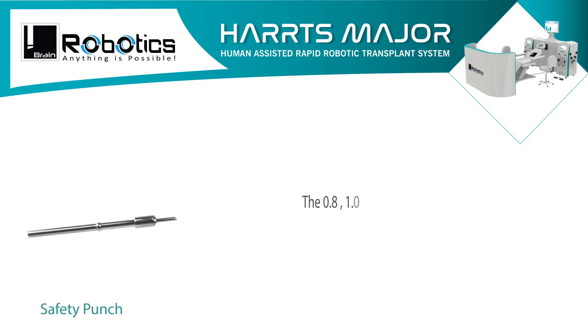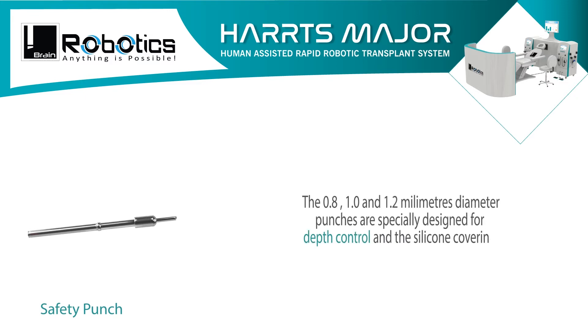The 0.8, 1.0 and 1.2 mm diameter punches are specially designed for depth control, and the silicone covering over the step avoids rotational skin abrasion.